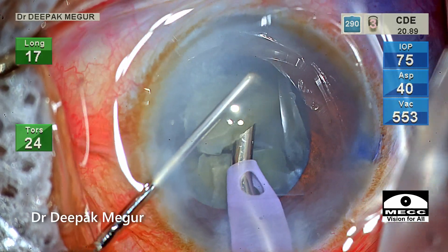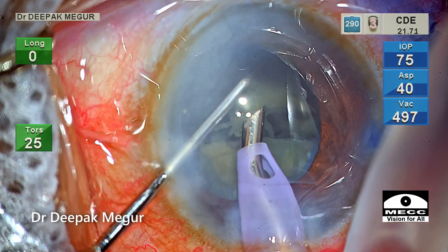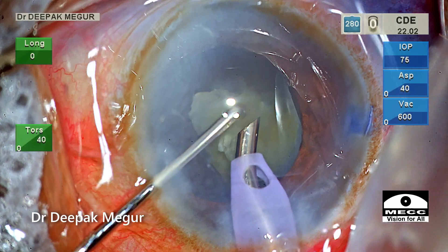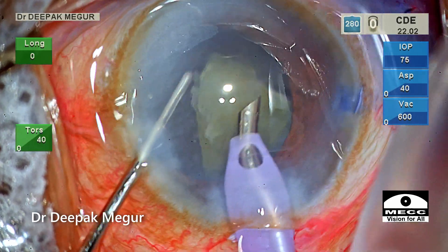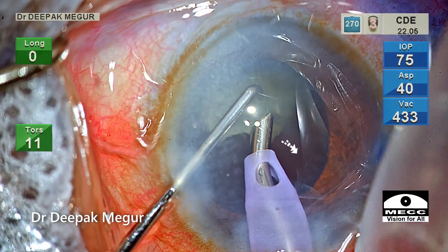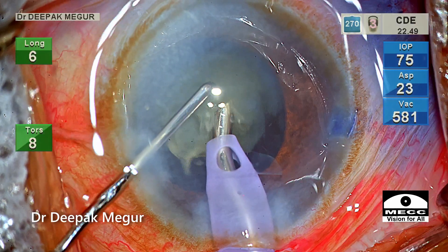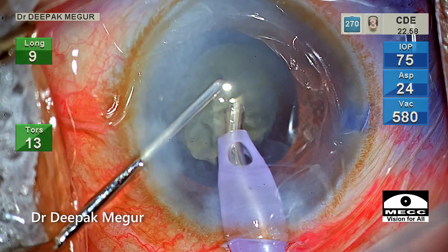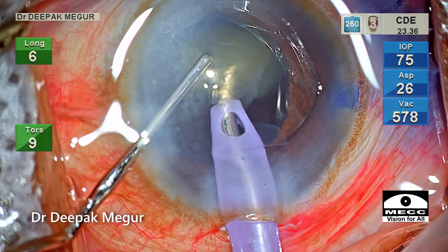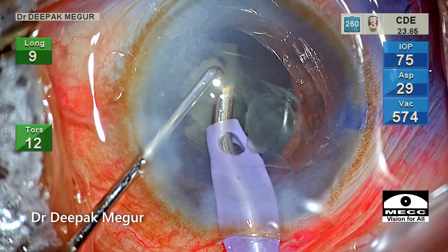The changes I make now: first, I don't want the phaco tip with the sleeve very close to the wound. I want to work staying stationary, ensuring that the sleeve holes are much more anterior to the torn edge of the Descemet's membrane. Usually after emulsifying the first hemi-nucleus in such compromised corneas I would come out and replenish viscoelastic, but that would carry risk here. So I've decided to continue emulsifying the remaining fragments without replenishing OVD. The phaco tip is held stationary — I'm conscious not to bring the tip near the wound. Only my left chopper is moving, feeding fragments into the phaco tip.